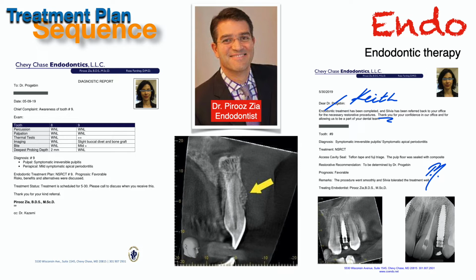Number one, I think before you do any type of surgery for implant, it's a really good idea to get a baseline for where the pulp of the adjacent teeth is. Maybe an endo consult, maybe you can do a pulp test yourself. Make sure you're starting with teeth that have vital pulps and that you're not going to have a tissue necrosis in a tooth nearby affect your surgery. That's tip number one.